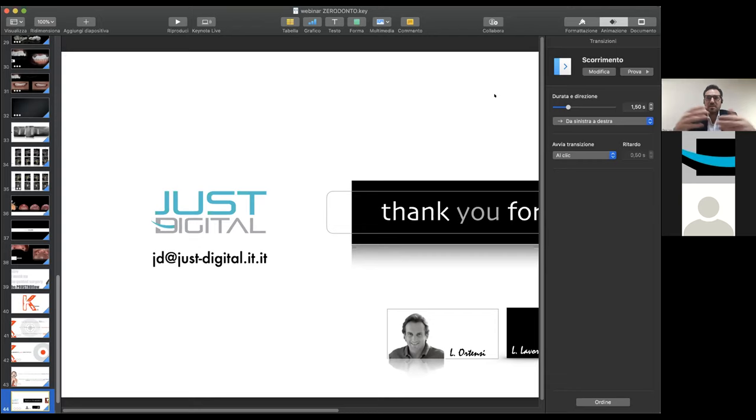You have a video conference with your engineer and you can give all your information, okay? And you can check exactly the design of the template before printing it. And as I showed you in the video, I always prefer to have a flap, especially for thin gingival tissue, as you can improve and achieve more volume for your gingiva. I never prefer a flapless surgery, never. So you can always work in a guided surgery approach.